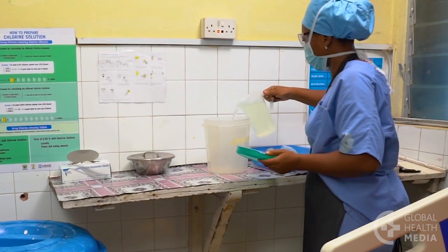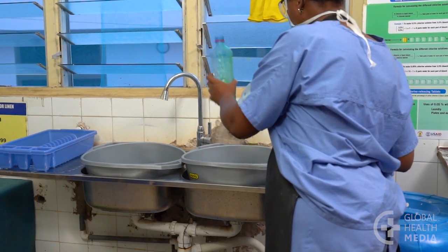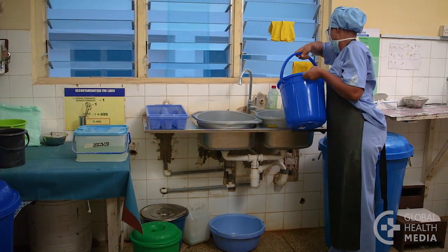Prepare a solution of 0.5% chlorine and soapy water fresh each time you need to clean the equipment.